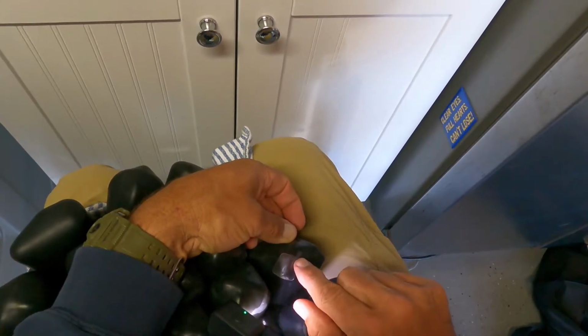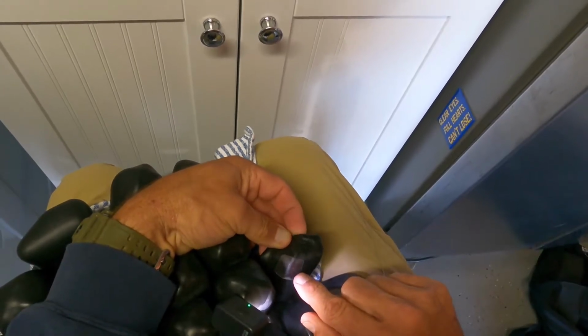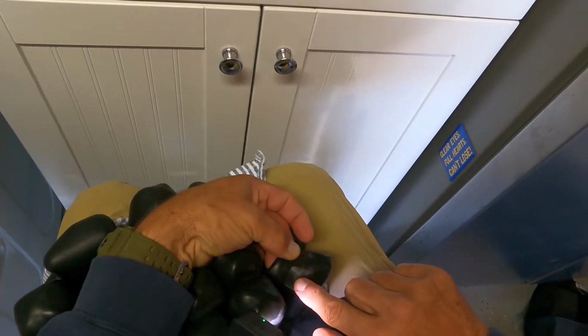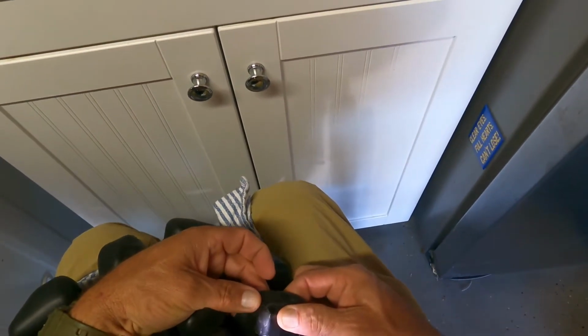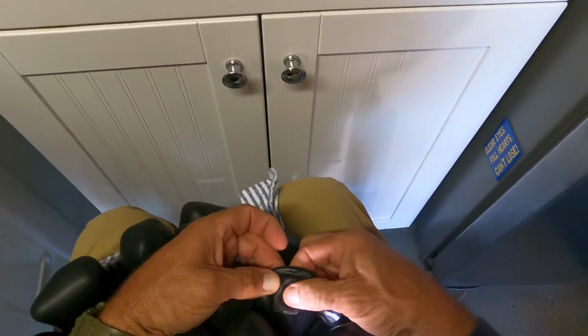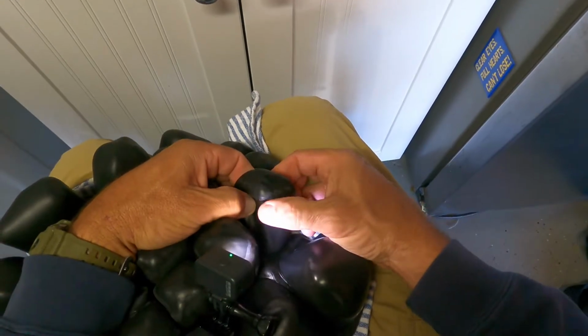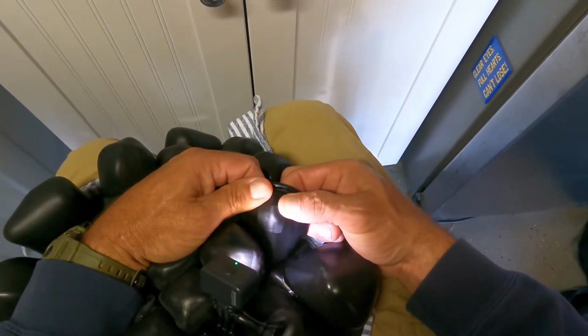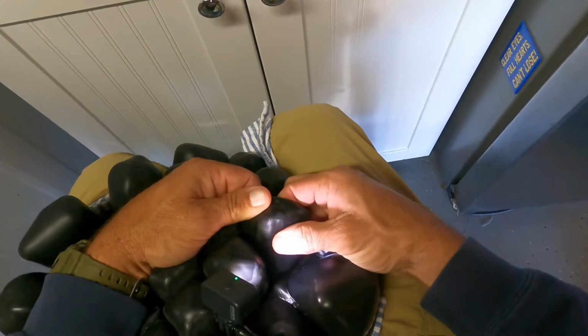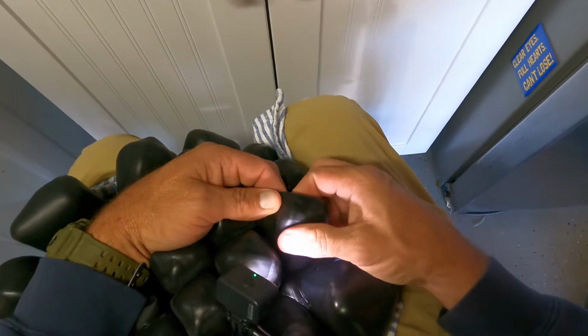And then let that thing just lay on there nice and evenly, no bubbles. That's why we want to push against the back of the cell to get a nice flush fit against there. Now, we want the whole patch to turn black, basically. The whole thing should be the same color as the cushion. That's how we know we're getting a good seal on the patch. See how that turns black, and now the whole patch looks like it's just a part of the cushion. And that's what we want right there.